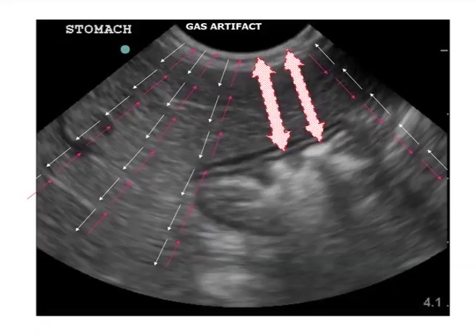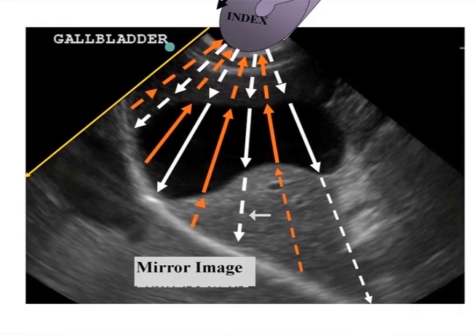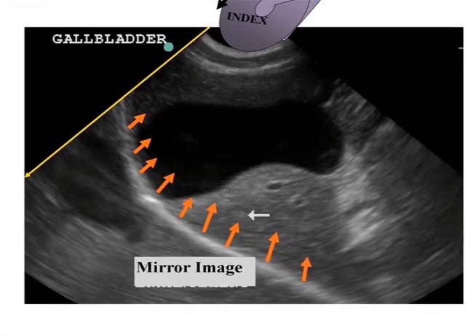In the Tips and Techniques DVD, we learn that gas strongly reflects the ultrasound beam. When imaging the liver and gallbladder, the ultrasound beam passes through and creates an image of the liver and gallbladder. Then the rest of the beam is strongly and completely reflected from the gas interface at the diaphragm and passes back through the same tissue in reverse order.